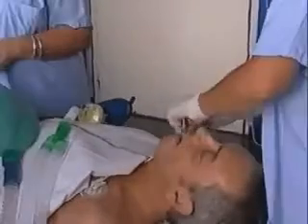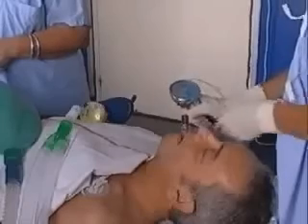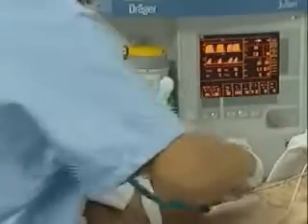Both cuffs are now inflated with only one inflation line. The pressure should be at approximately 60 cm H₂O, which should be monitored continuously during the whole procedure with a cuff pressure gauge.